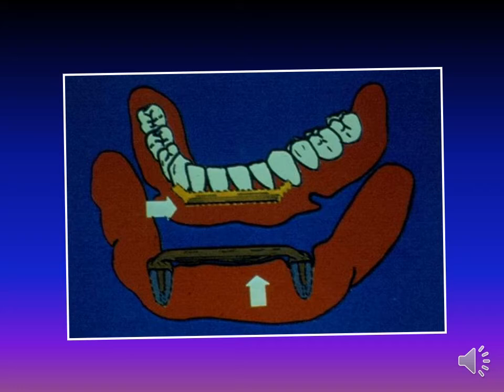Most of the stud attachments are simple in design, consisting of a male stud that is soldered to the base of the coping, and in other cases the female portion can be soldered to the base. The coping covers the prepared tooth stump, usually having a post extending into the endodontically treated root canal.